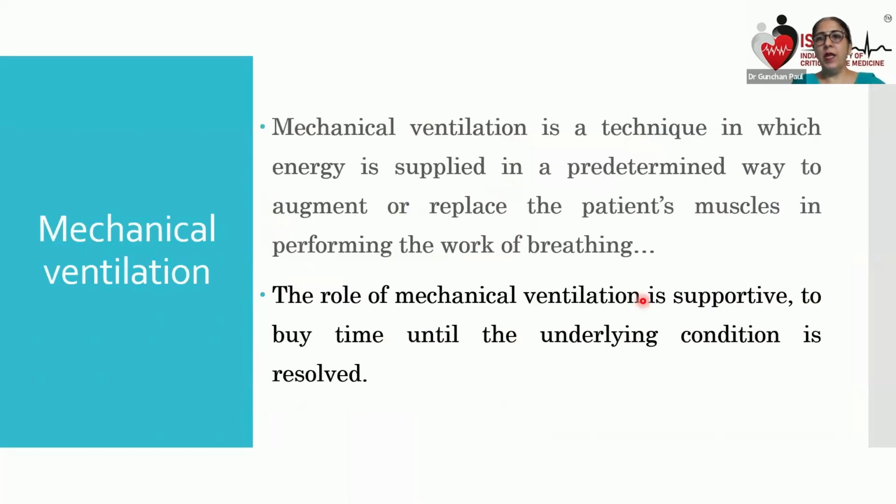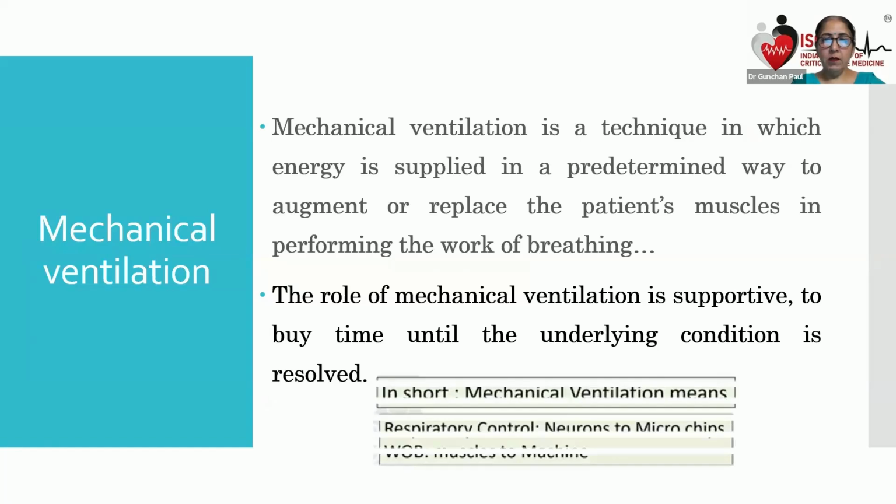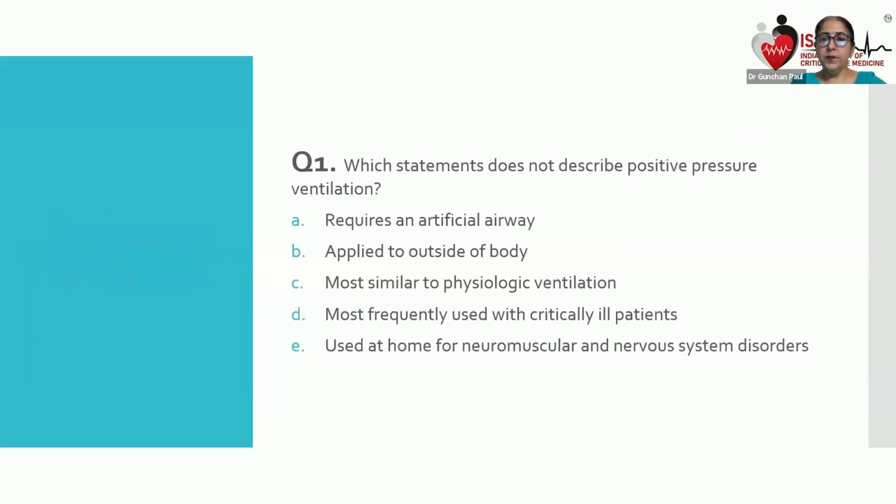So how can we describe mechanical ventilation? Mechanical ventilation is a technique in which energy is supplied in a predetermined way to replace the effort or the work done by the muscles of the patient. The role of mechanical ventilation is supportive till the primary disease heals. I can say I give the control of breathing from my neurons to the microchips of the ventilator's computer, and the work of breathing, instead of the muscles, is done by the machine. That is what mechanical ventilation is.